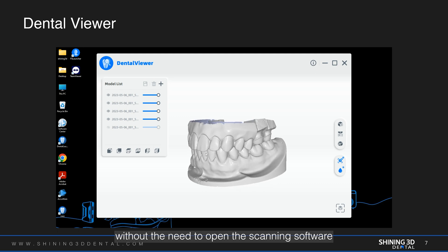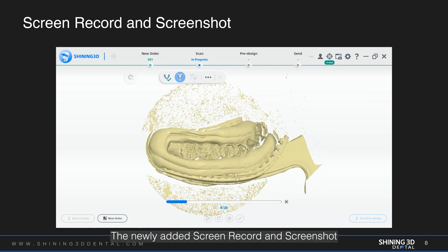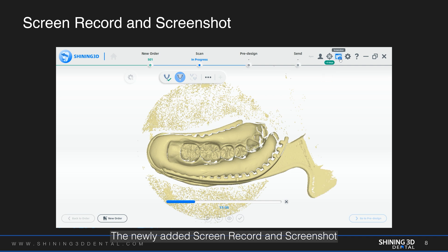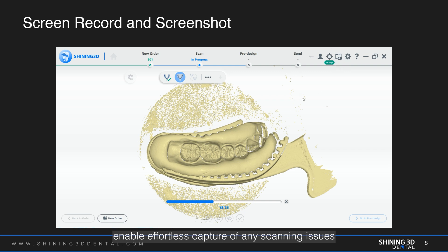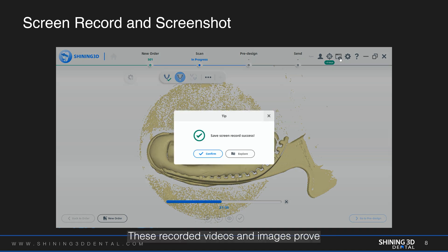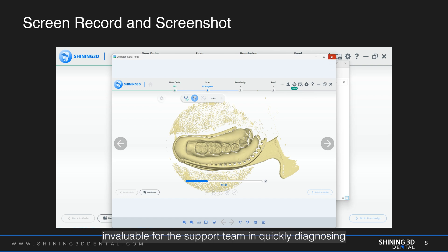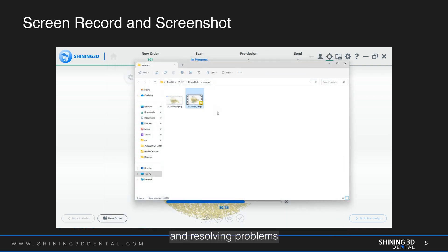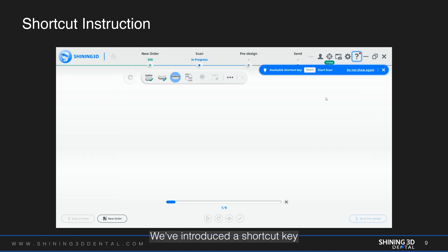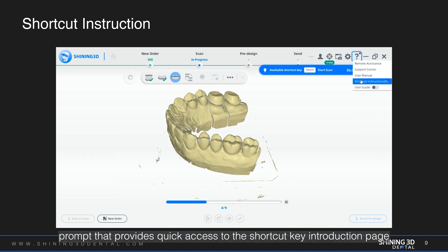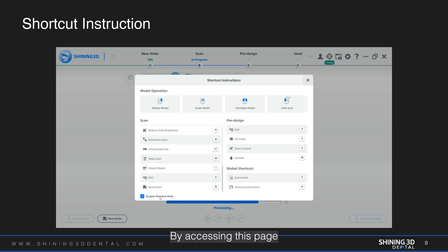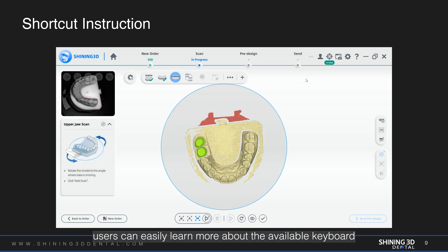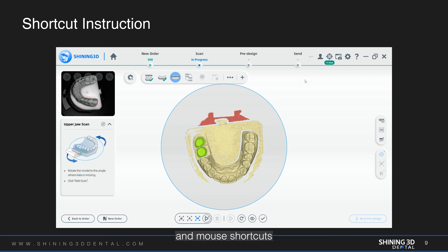The newly added screen record and screenshot features in the top right corner enable effortless capture of any scanning issues. These recorded videos and images prove invaluable for the support team in quickly diagnosing and resolving problems. We've also introduced a shortcut key prompt that provides quick access to the shortcut key introduction page, where users can easily learn more about the available keyboard and mouse shortcuts.